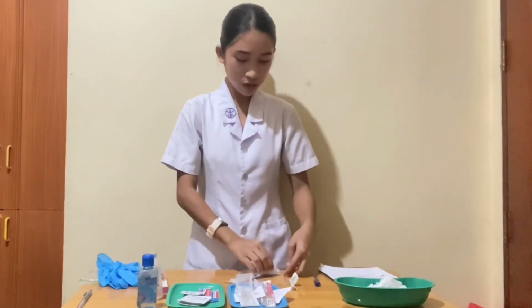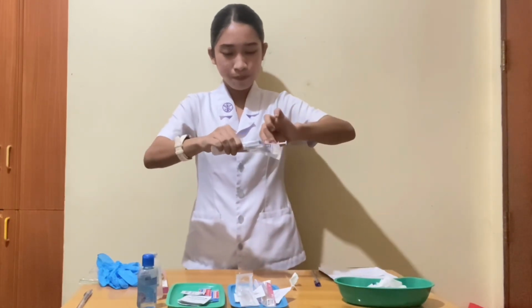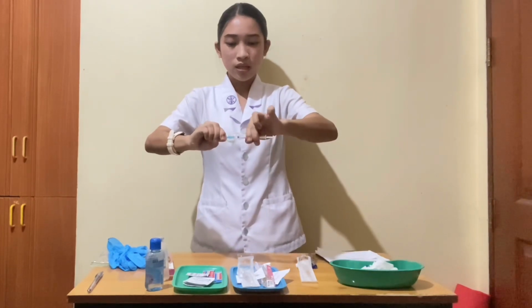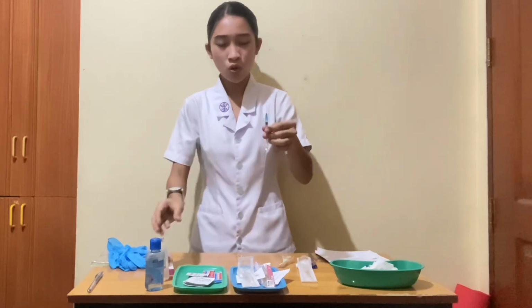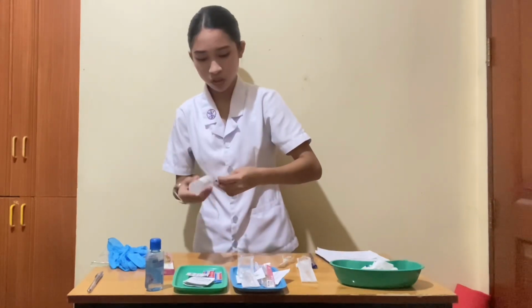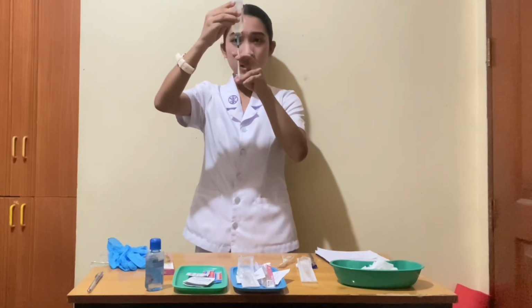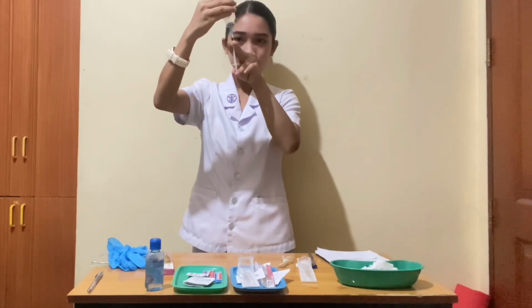So subcutaneous, and then I'm just going to open this one, get the injection, open it like this, so it is open. I'm going to do the bevel up, then down, then I'm going to withdraw again from the inverted vial, 0.1 ml.